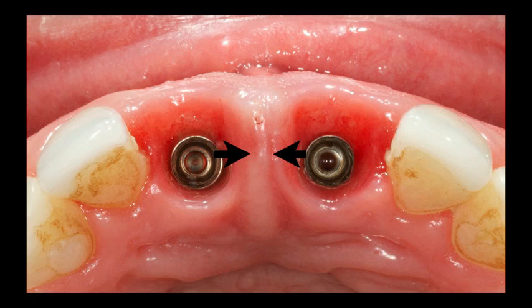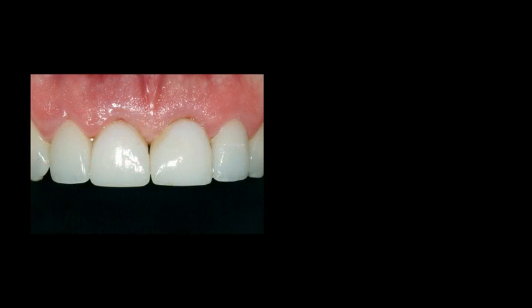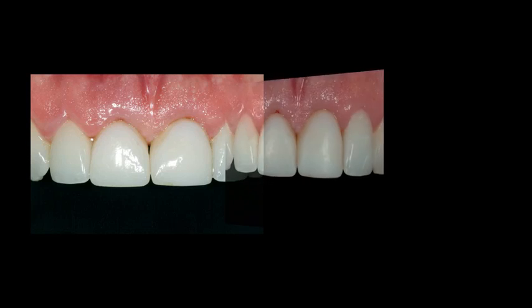So if we push on it subgingivally and leave a little space for a peak of tissue, the tissue should reconform to that shape that we're asking it to follow. So here I'm just adding flowable composite subgingivally, and then we place these provisional crowns. They're not splinted anymore. The patient can floss and have better oral hygiene, and I've left a little bit of space so that we can have a better peak of tissue created.